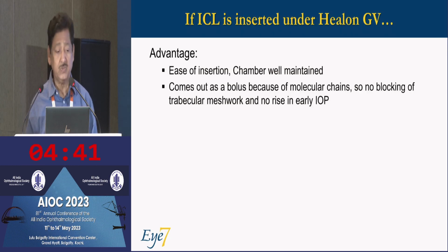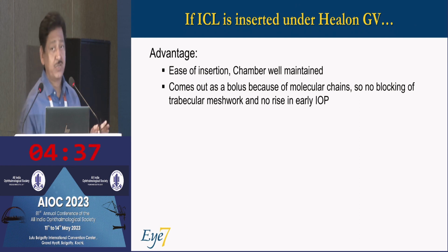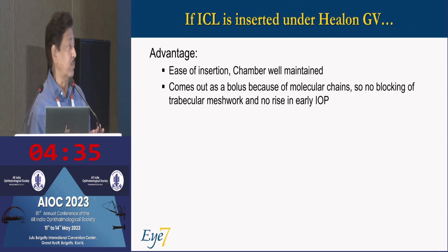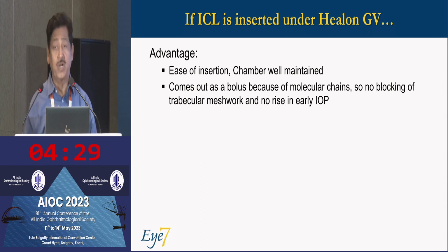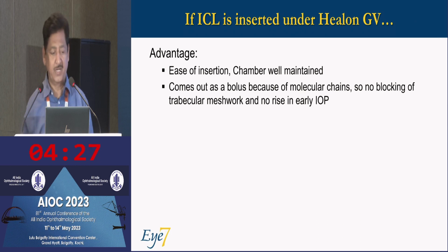Dr. Shri Ganesh was the pioneer who talked about putting ICLs under Healon GV, and it is doing very well. Even I did that and was very happy with the technique.